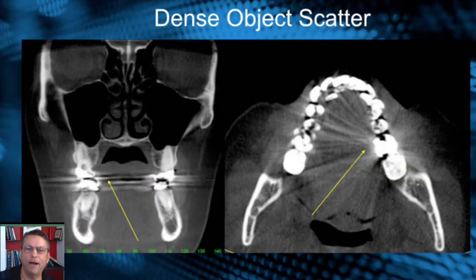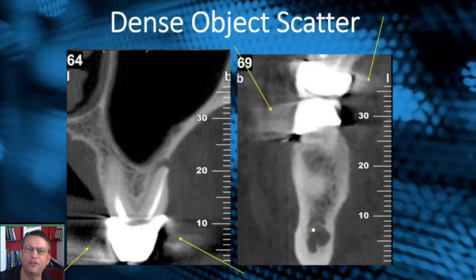And dense object matter, such as metallic objects, what we talked about, introduces noise into your scan. You get scatter onto the scan because of the noise. And there's nothing we can do about these things. This is dense object matter scanning and scatter. That's just the limitation of cone beam as of right now.